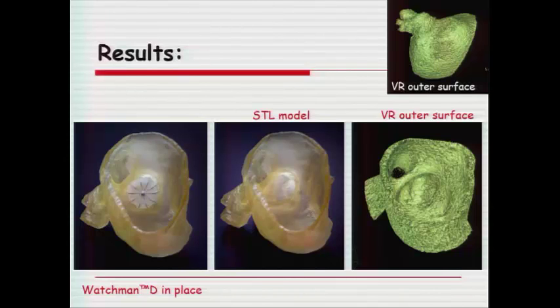You can see that we have thickened it on the outer surface because we needed to actually print a model, and the wall of the left atrial appendage is very, very thin. However, we made sure that the actual details from the CT data of the inner part are totally relevant. As we look here, we can see that this is the orifice of the left superior pulmonary vein, and this is the orifice of the left atrial appendage. We can see that with the printed model as well.